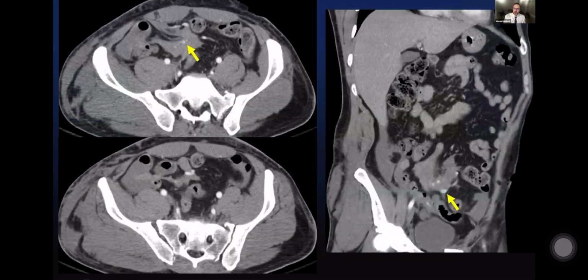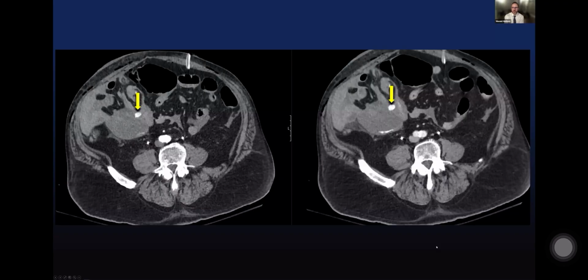It's really important to observe hemoperitoneum, number one, but also to account for why it's there. If someone has hemoperitoneum and they don't have a solid organ injury, your mind should immediately go to, is there a bowel or mesenteric injury that I am missing here? In this case, thankfully, it was quite apparent because of the active bleeding within the small bowel mesentery. This is a case of someone with a mesenteric injury.